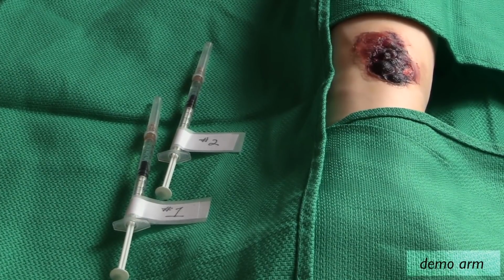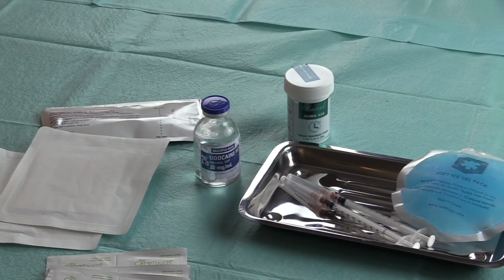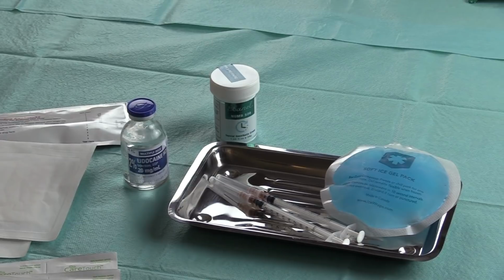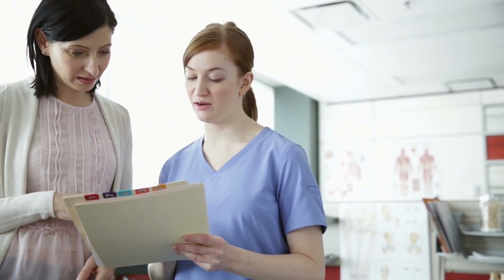Any items that will be used for patient treatment should be set up by the nurse or study coordinator. Pain-relieving medications such as lidocaine and EMLA cream may be used. Ice can also be used prior to treatment. Additionally, gauze, sterile gloves, and iodine, or whatever's being used for sterilization of the treatment area, should be available for the investigator. This concludes this section of the training video.